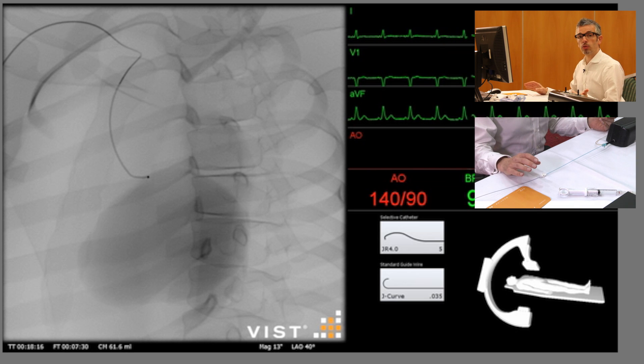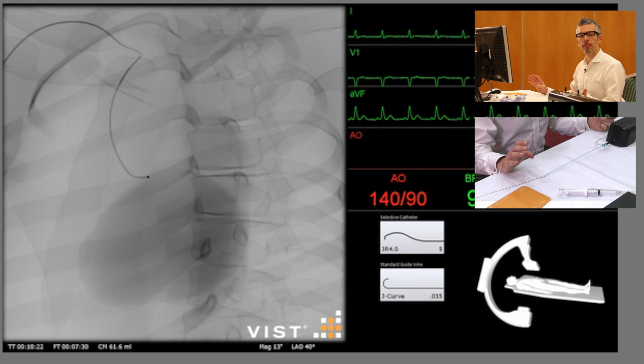Remember, before taking any shots at all, you should always check that the arterial pressure tracing is a normal one and not damped in any way. If it's damped, it may indicate that the tip of the catheter is up against the wall of the artery, or particularly on the right coronary artery, that it's into the small conus branch.